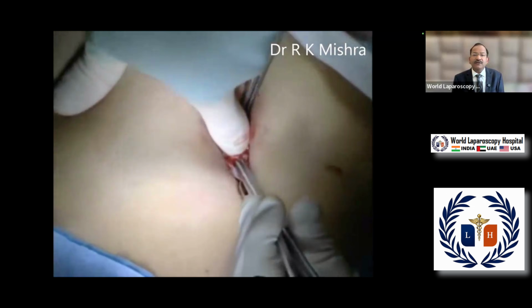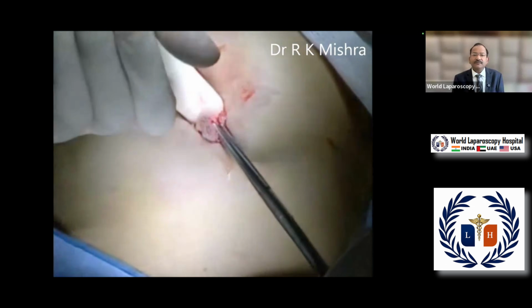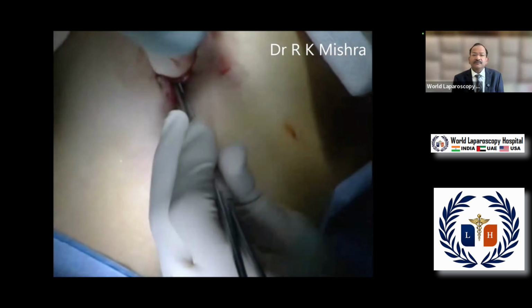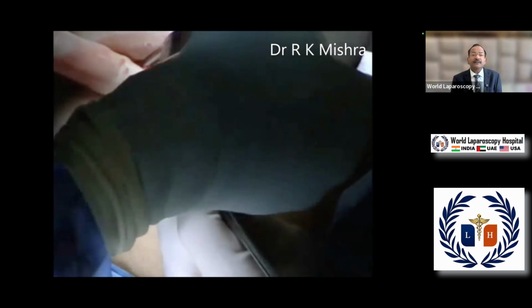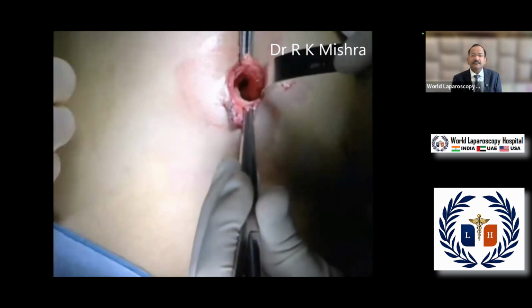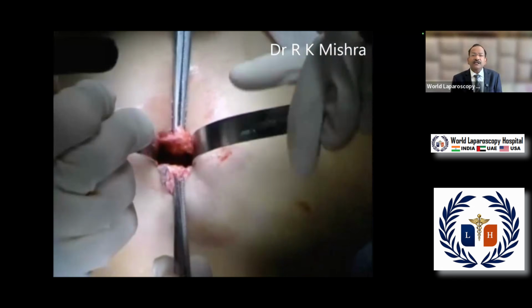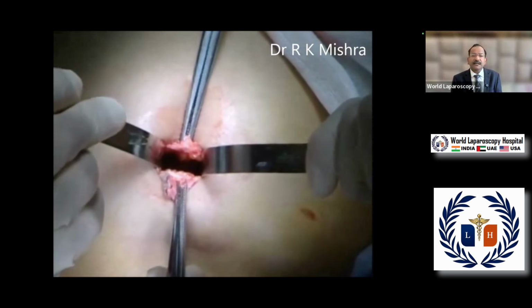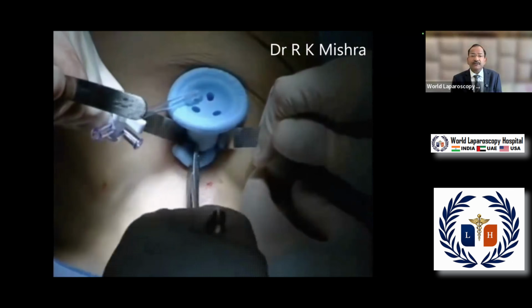and after that you dilate the wound with the S retractor, and all of this is going on in the inferior crease, not transumbilical. And then put the Sills port. This is a single incision Sills port, 20 mm port. This is a 20 mm port.